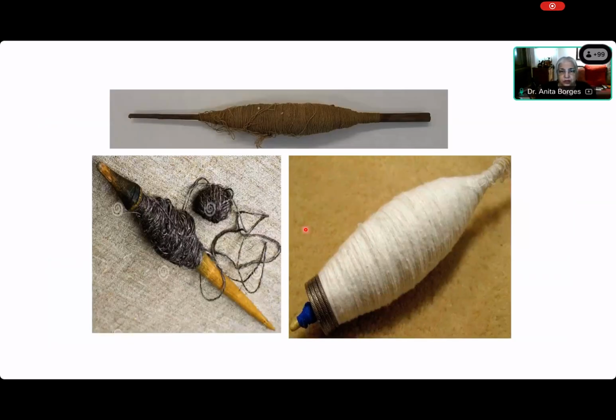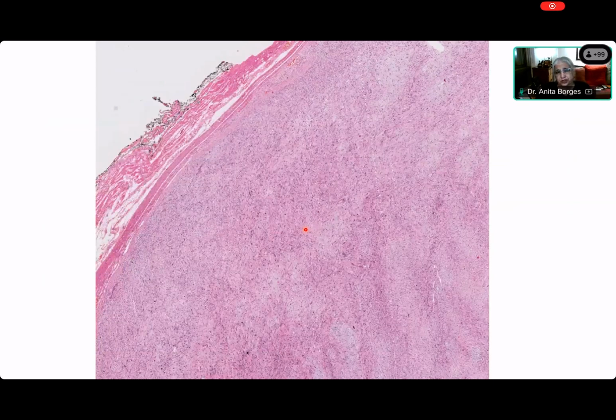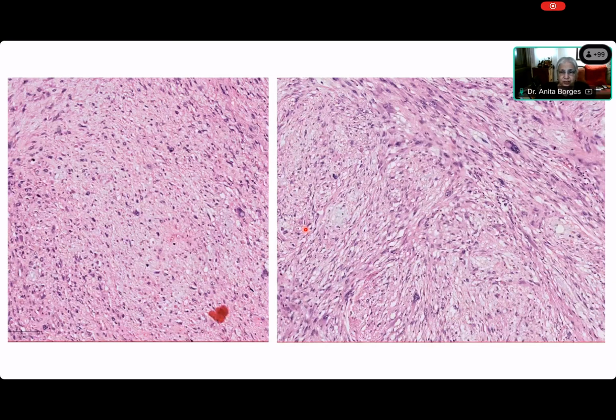All right. Now I'll quickly tell you what are the answers to these other things. This is a retroperitoneal mass in an adult male, huge mass, and you see this. It looks as if it's encapsulated, but it's so huge that it has pushed all the tissues to the side and it looks like it has a capsule. Okay, and it's myxoid. It's not only myxoid, it's pleomorphic. You can see that. It's myxoid, partly collagenous here and there, and pleomorphic.